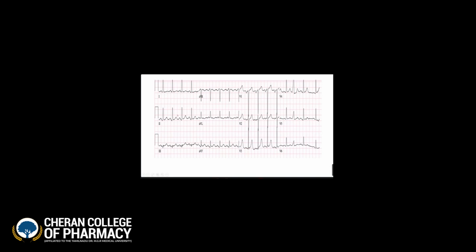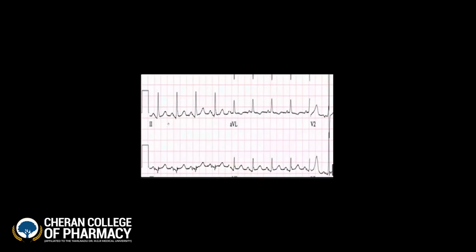Okay. Now coming towards the P wave abnormality. Is there any kind of P wave abnormality here? From the naked eye, we can see, is it enlarged or M shape? Everyone, M shape or enlarged? Enlarged. It is the reciprocal changes. Yeah, it is enlarged, not M shape.